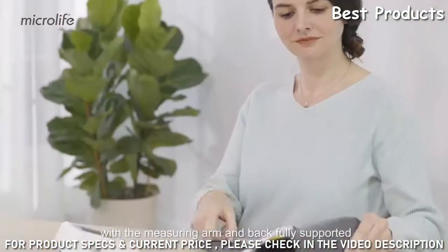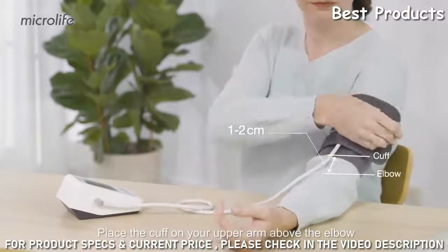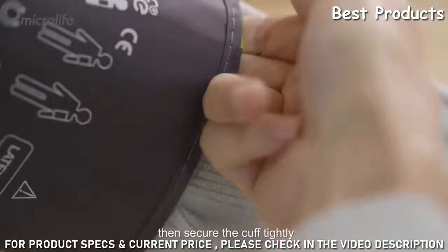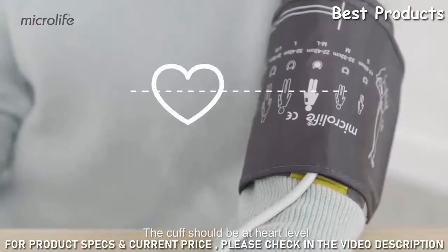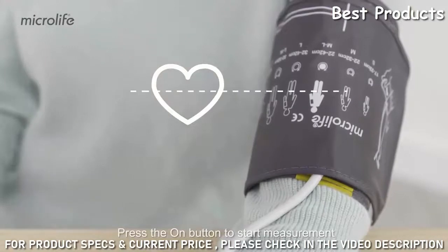With your measuring arm and back fully supported, place the cuff on your upper arm above the elbow, then secure the cuff tightly. The cuff should be at heart level with the artery mark aligned with the brachial artery.